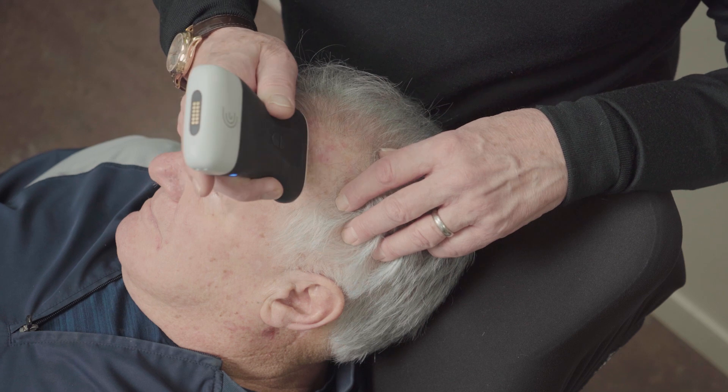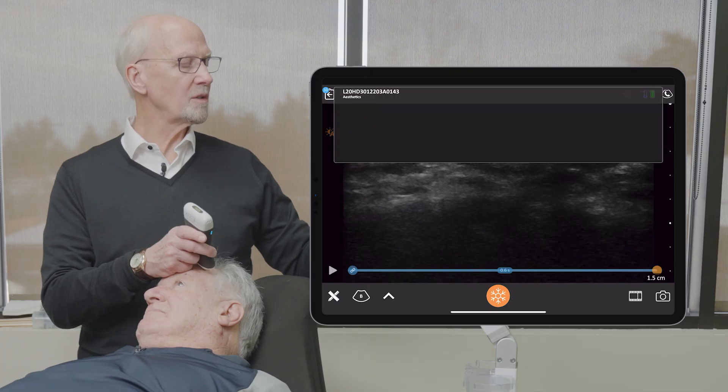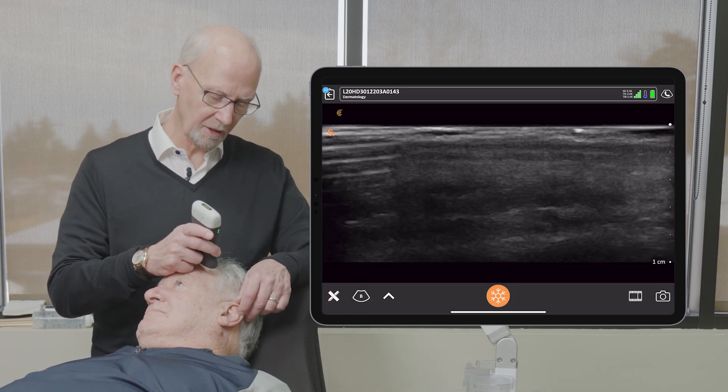I'm going to put the ultrasound on the area now, start it up, and go to the dermatology pattern. We're going to do it at one centimeter depth.